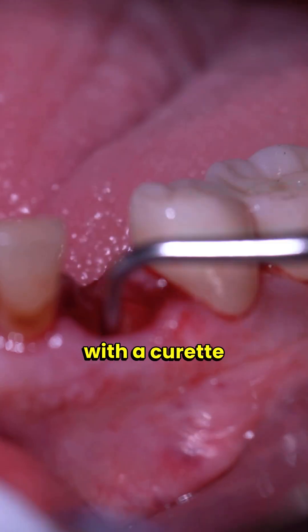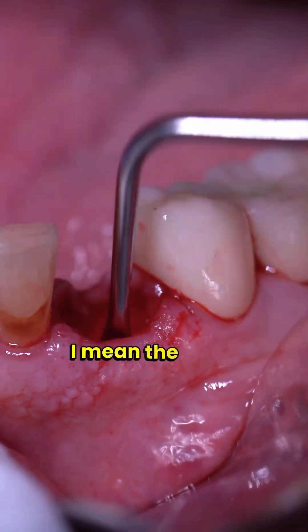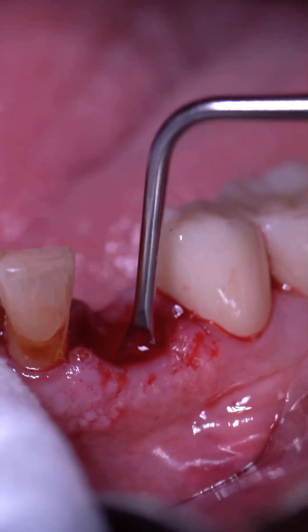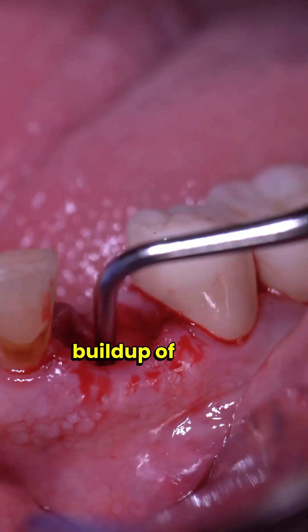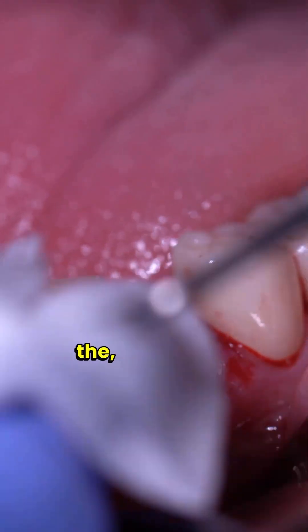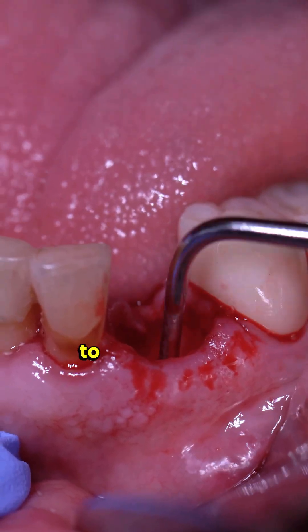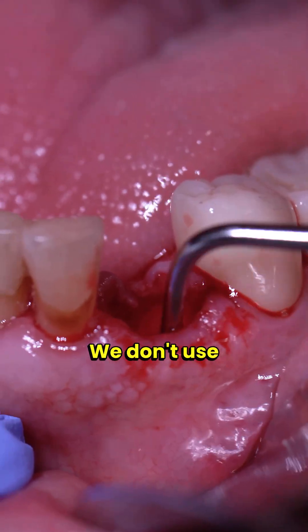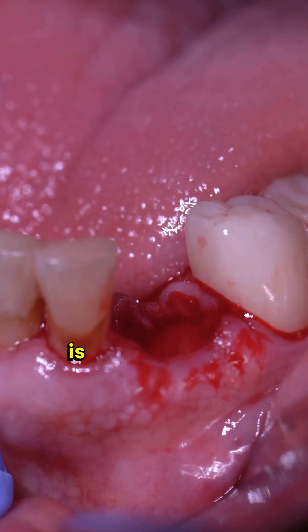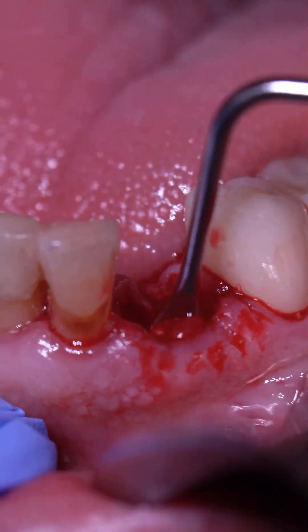Now I'm coming in with a curette because you always want to debride the tooth socket. The tooth needed to be extracted for a reason, and generally when there's infection you're going to have some buildup of infected tissue at the base of the socket. I'm going to debride and irrigate with saline — we don't really use chlorhexidine; saline is the material of choice for irrigation.